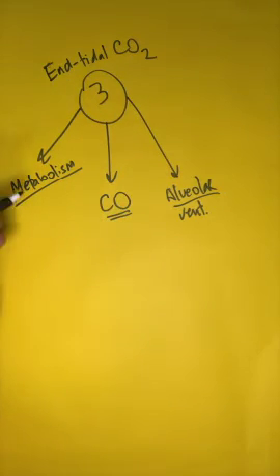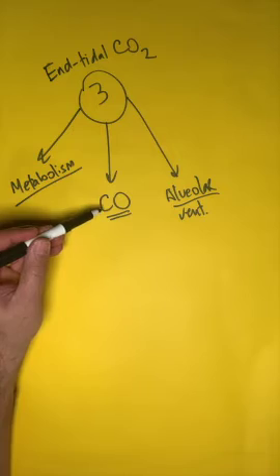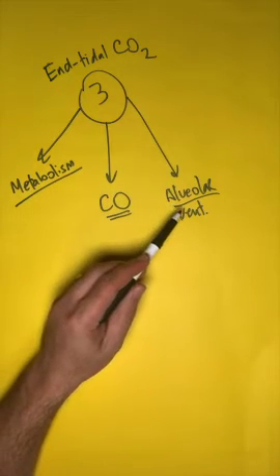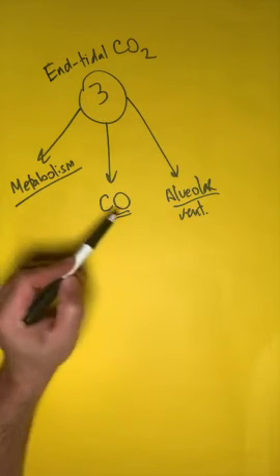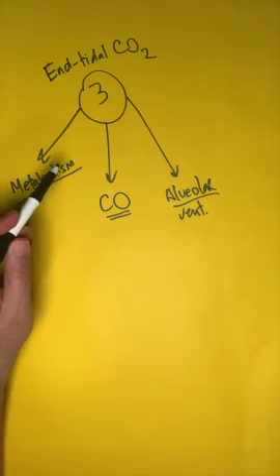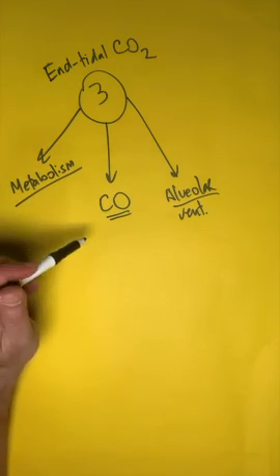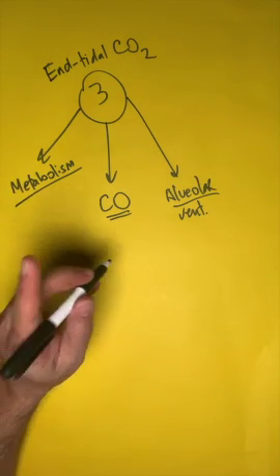If you have a patient, for example, who's in shock and the cardiac output is changing, you should not use end-tidal CO2 to monitor ventilation, because these two things are varying. But if you have a person that has just one of these variables changing, you could rely on end-tidal CO2 to monitor those things. So just keep that in mind.